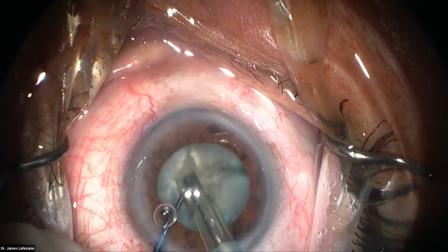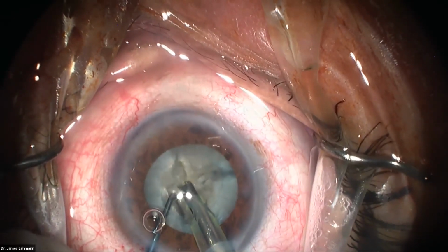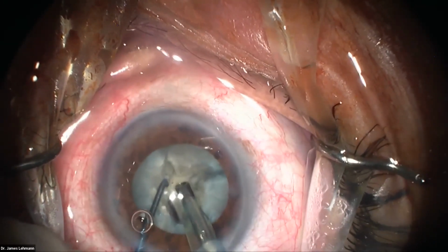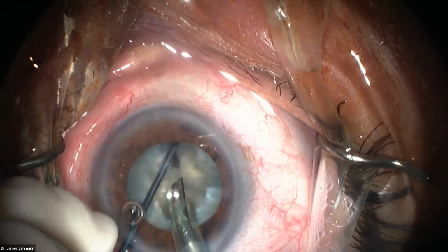Really, getting that first crack is the hardest part. So now I'm at the right depth. There's a little fragment. I'm going to get that out. That's just a little debris blocking our view. Now you can see I'm at the same depth. Crack that bad boy like that. There you go. Now we're going to rotate again.